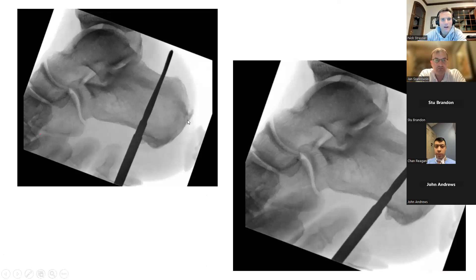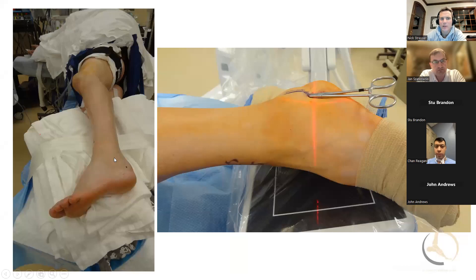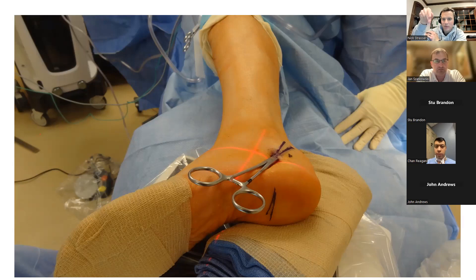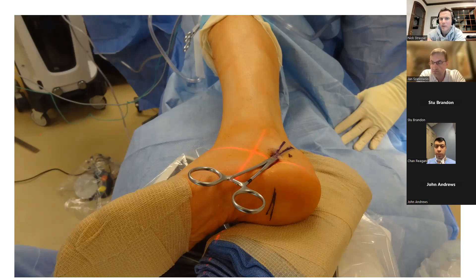This is a Zedic osteotomy — this is Oliver's work, and this is mine. Setting him up for the osteotomy, I'm using quite a bit of fluoro to mark out my vertical limbs for my proposed osteotomy. I do that with him in the lateral position. I use a mini C-arm in this case, though a regular size C-arm is reasonable. You can get that mini C-arm in there, especially with a bigger field of view. I mark out on the bottom of the foot where I want my burr to go as I'm passing it from lateral to medial, and then mark out where my limbs are going to be.